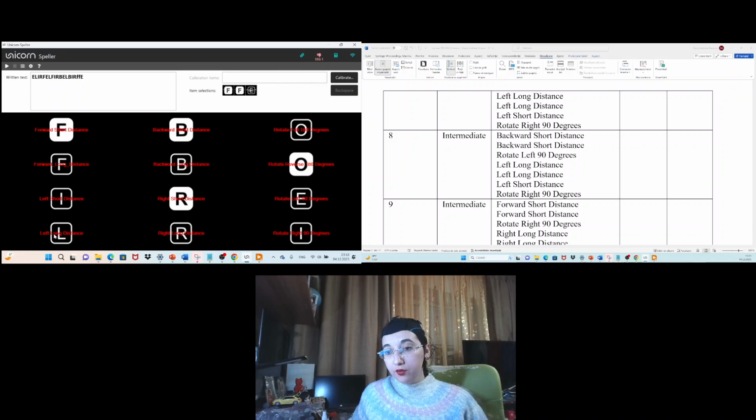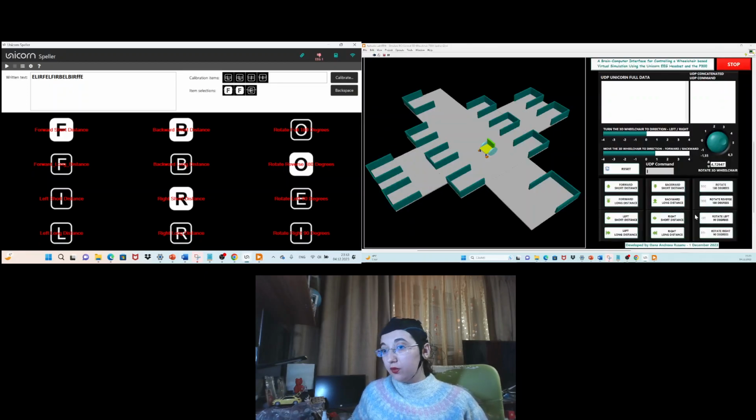So left long, left short, and rotate right 90 degrees. Okay, let's continue. So you could see that it is also possible to manually control the 3D wheelchair by different movement direction.